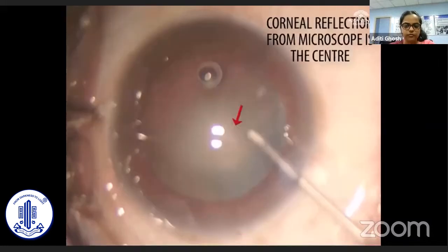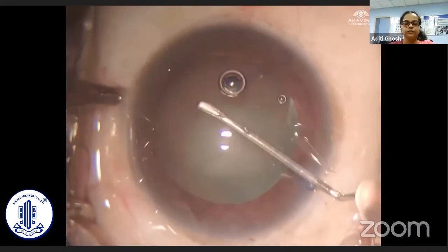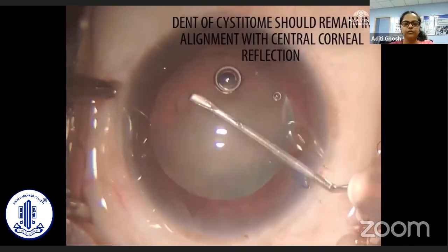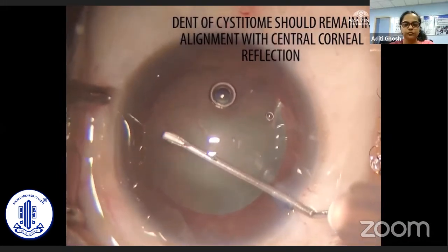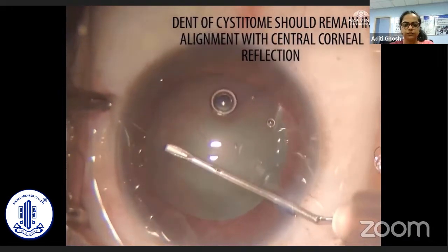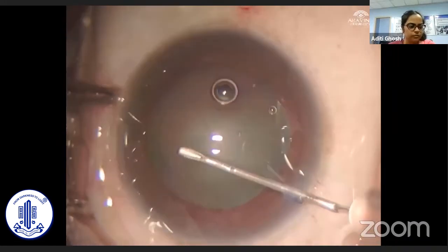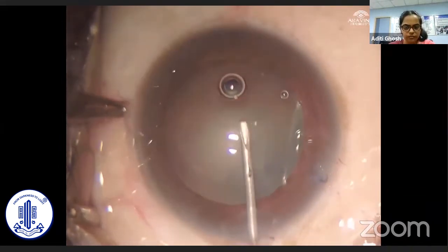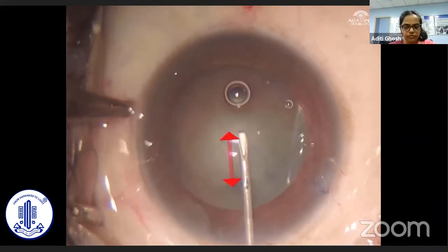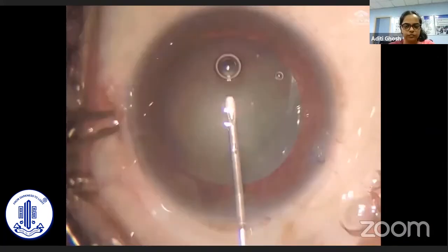For intraoperative application, the corneal reflex of the microscope is used as the rhexis center. The rhexis flap is then raised routinely, keeping the dent of the cystitome in alignment with the corneal reflex to obtain the adequate rhexis radius. A circular and adequate rhexis is ensured in all clock hours by repeatedly measuring the rhexis radius while maintaining alignment of the surgical landmarks: the central corneal reflex, the margins of the rhexis, the tip of the cystitome, and the dent on the cystitome.